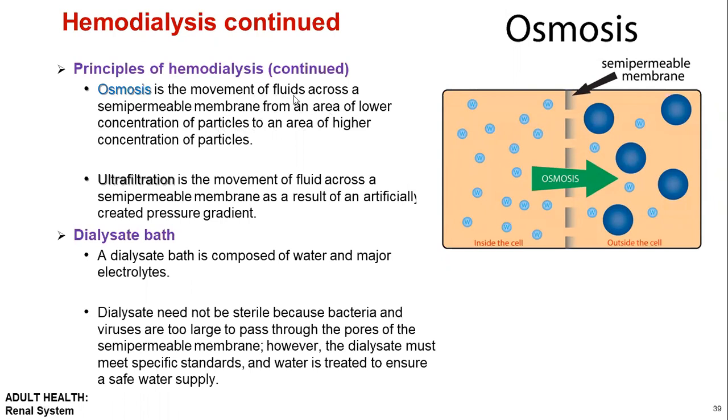So this is a movement. Ultrafiltration occurs here.